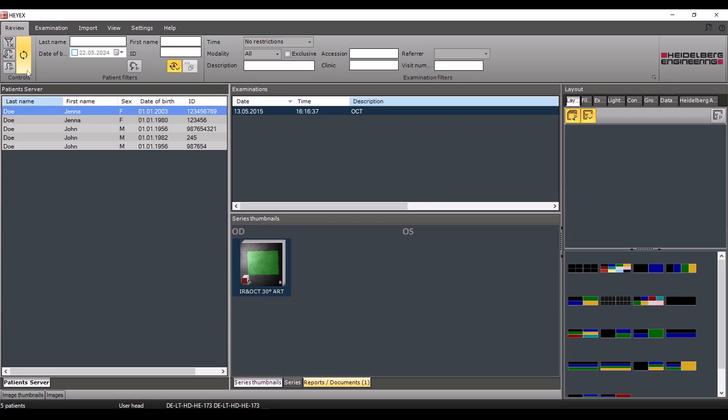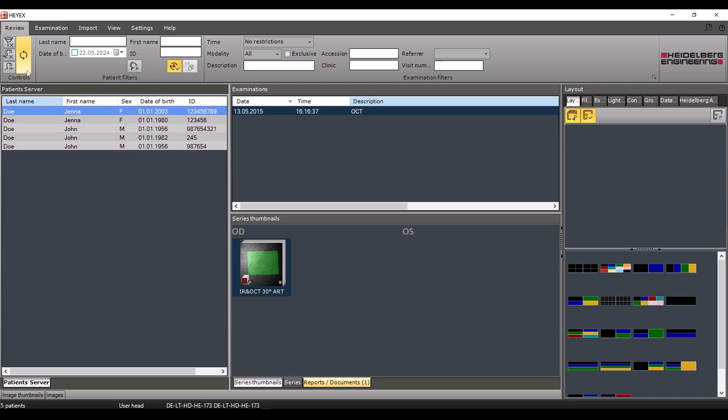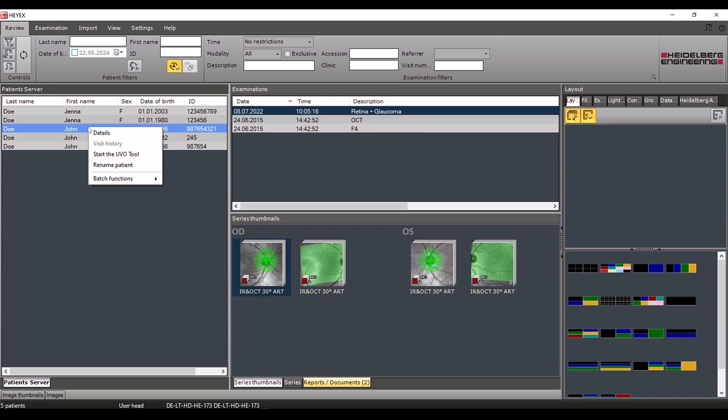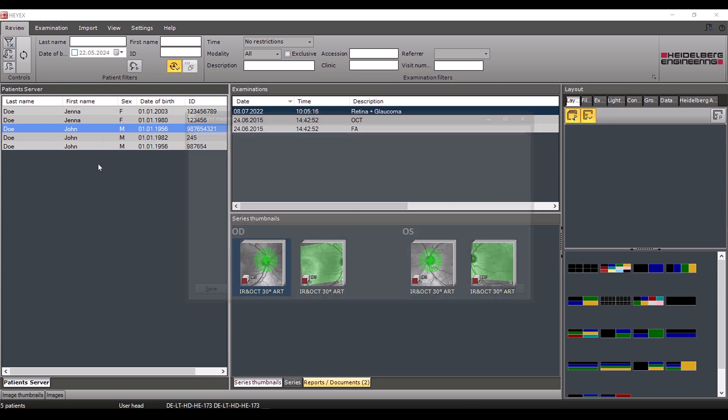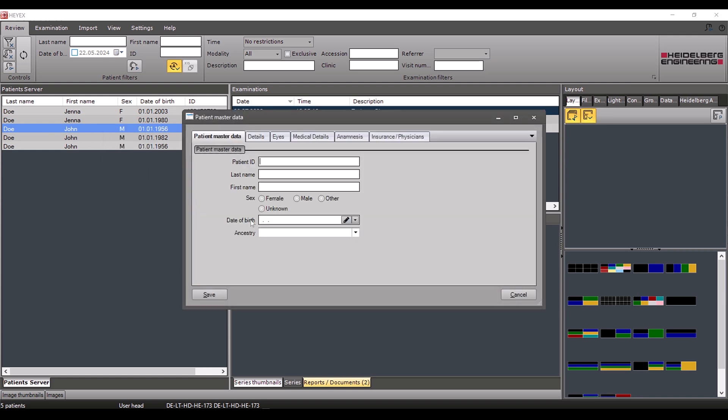If a patient has been created twice in the system by mistake, the two entries can be merged subsequently. To do so, first compare the master data of the patient entries in question. In this case, do they have a different ID? Right click the patient with the incorrect information and select rename patient. Correct the respective data, in our case the ID, and save it by clicking save.